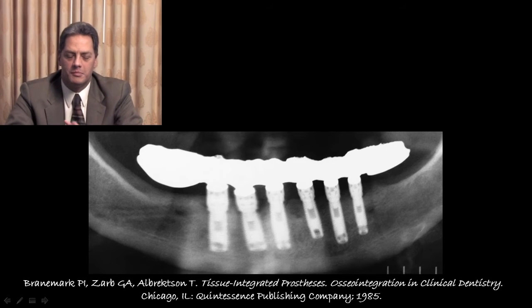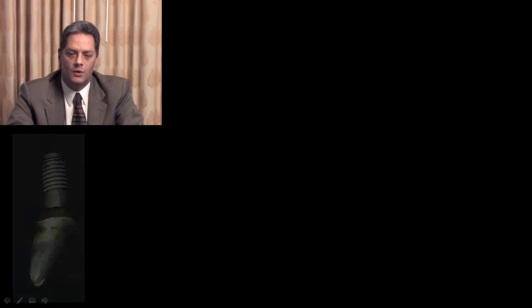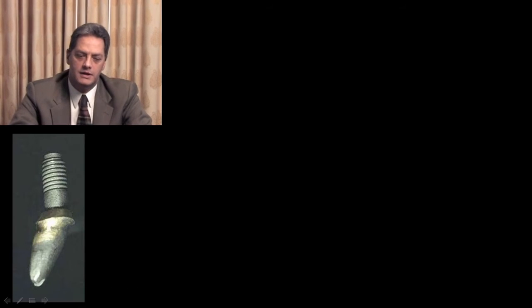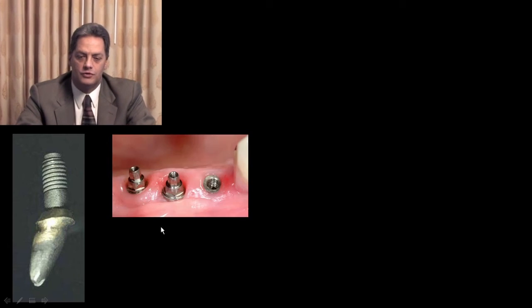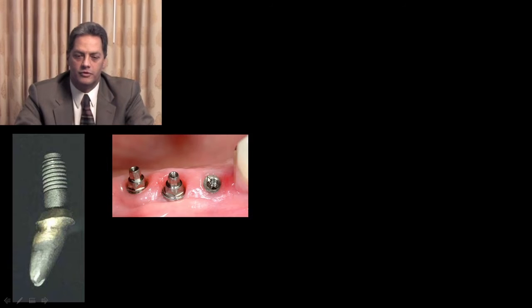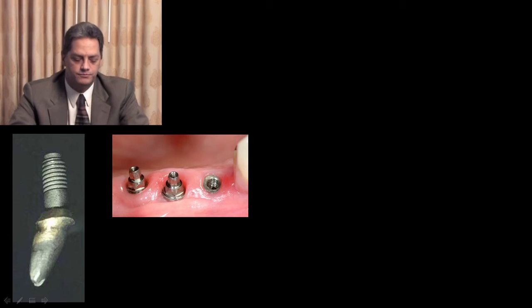So we need to know what materials are going to be utilized so they are long-lasting ones. And with the evolution in implants, he did not foresee that the implants were going to be copied into implants that have no anti-rotational device, as we see here with this implant. And many times we did these angulations, the timing on the threads was critical into the final position of the abutment.